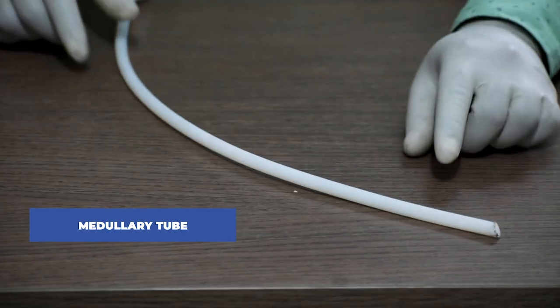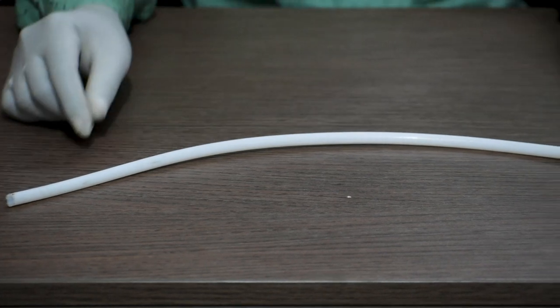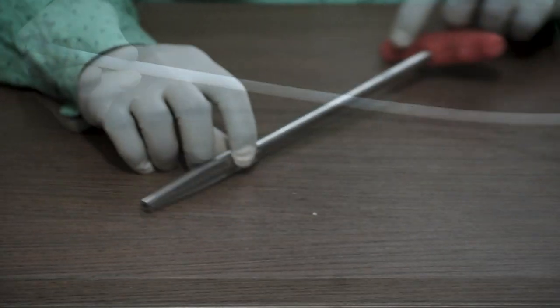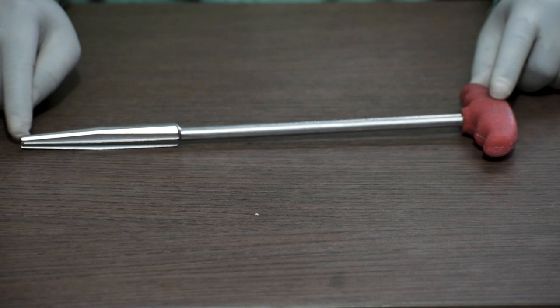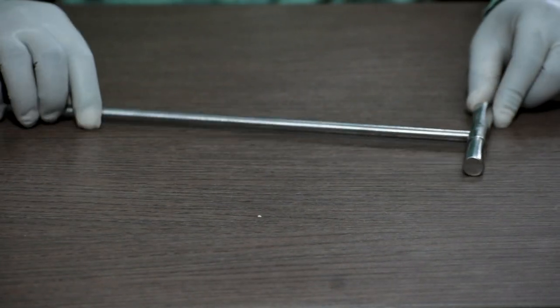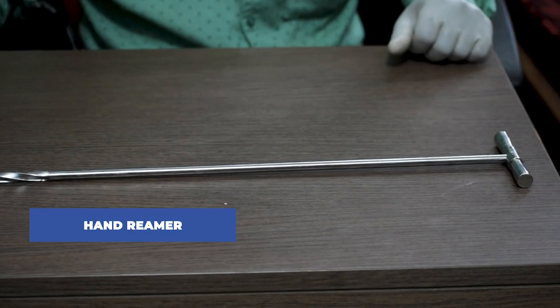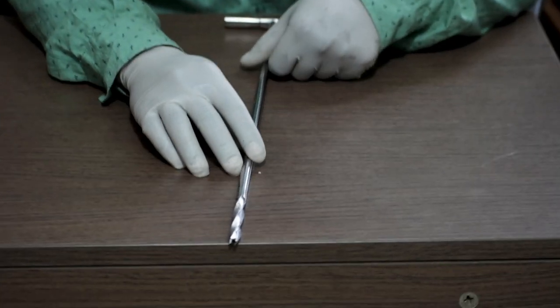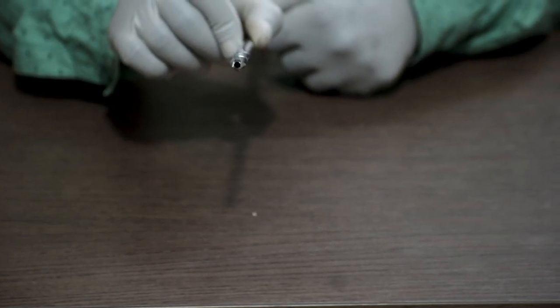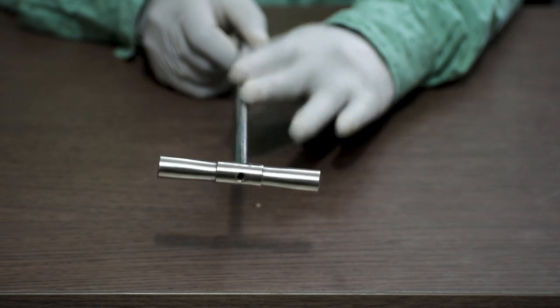This is called a medullary tube or an exchange tube. This is a proximal reamer; the diameter of the proximal part is 15 mm. Next, this is a hand reamer — a cannulated one, available in diameters of 8 mm, 9 mm, 10 mm, 11 mm, and 12 mm.